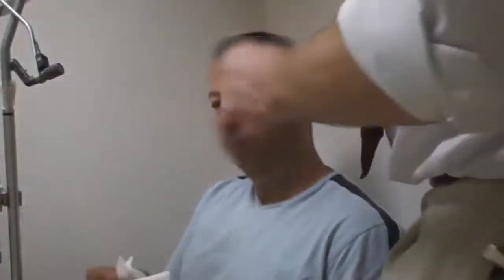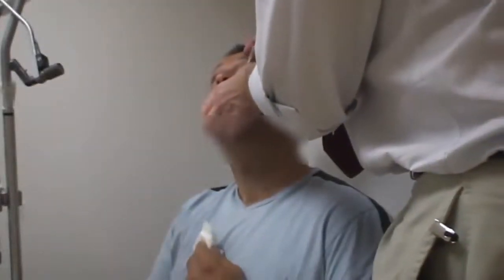I'm going to start by applying some Benoxinate. Head back for us — I'm just going to drop a couple of drops in your eye. It's going to sting a bit, okay?